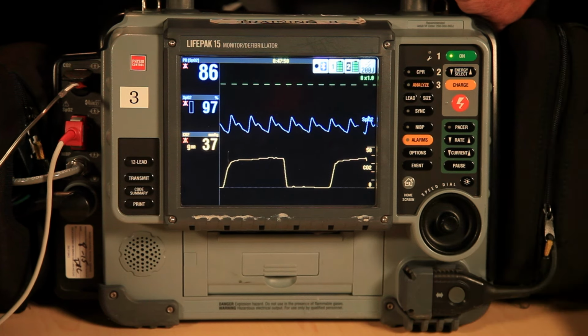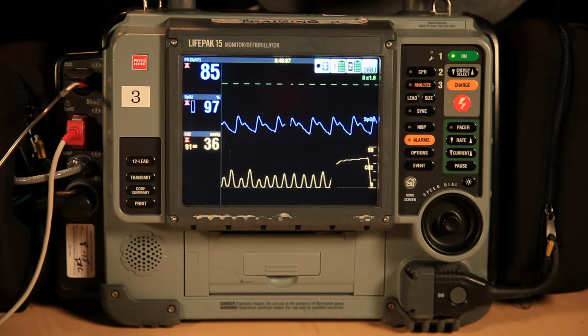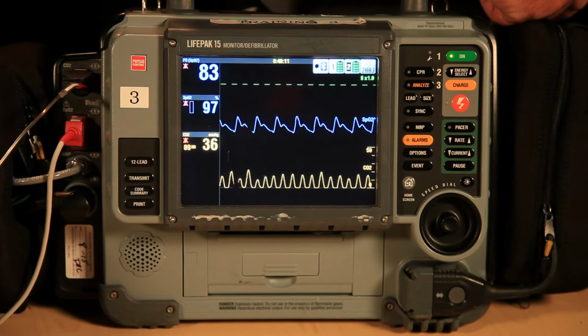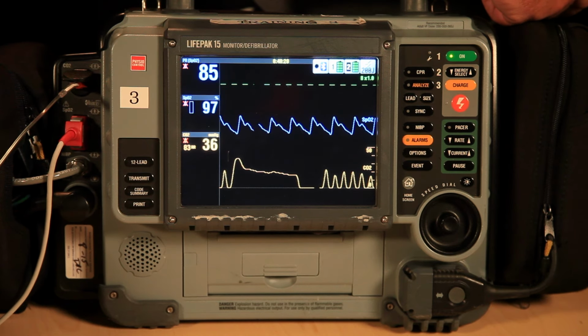you'll notice that there are more box-shaped waveforms across your screen. This is indicative of a faster respiratory rate. You also notice that the capnometry reading will decrease as he's blowing off carbon dioxide. If for some reason he were to slow his respiratory rate to a lower rate, you would see fewer box-like waveforms on the screen.